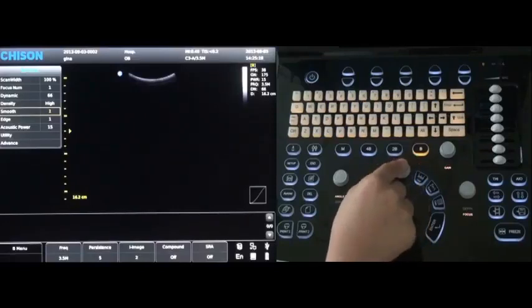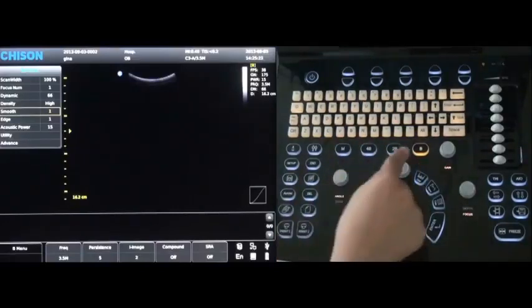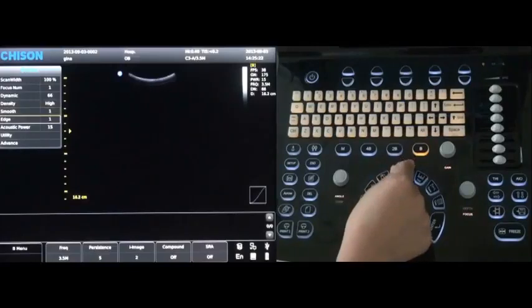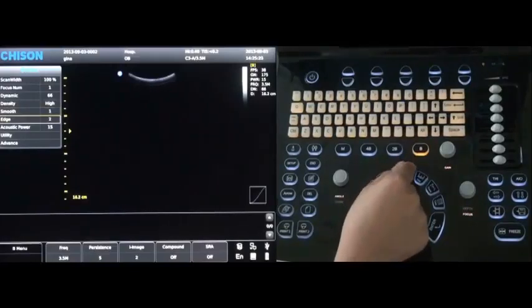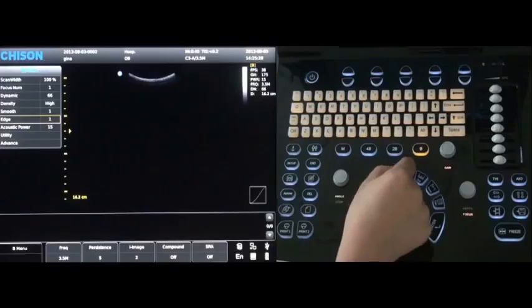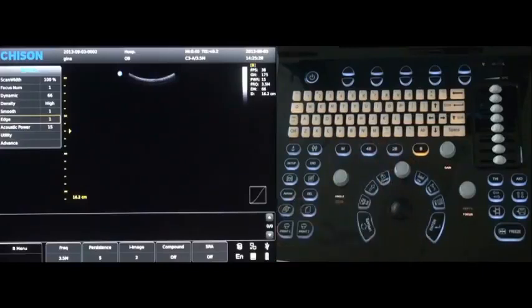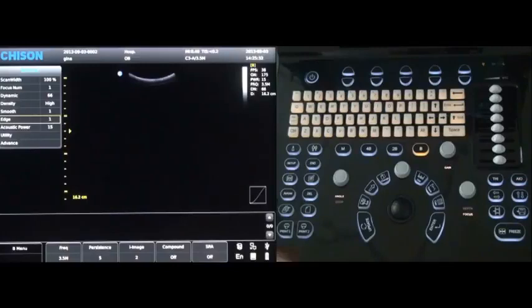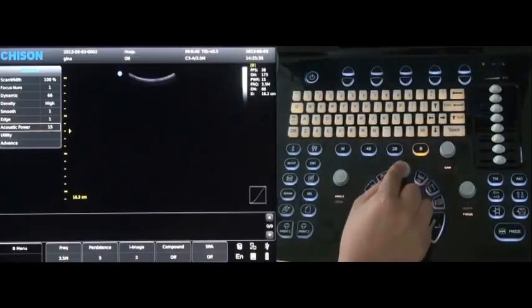Go to edge, you can choose the different level of edge. Go to acoustic power to change the acoustic power.